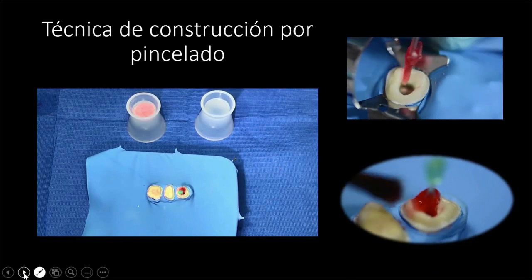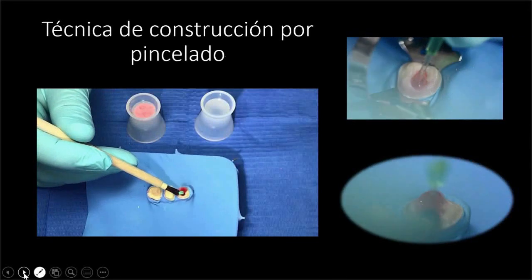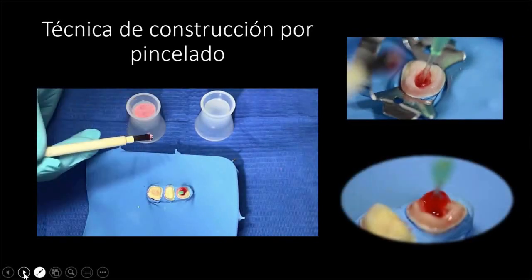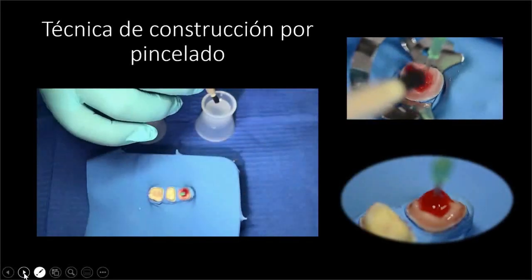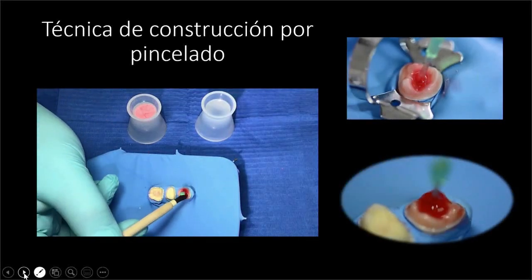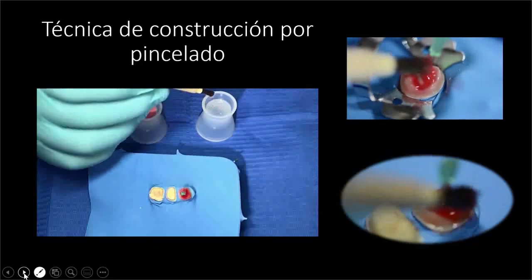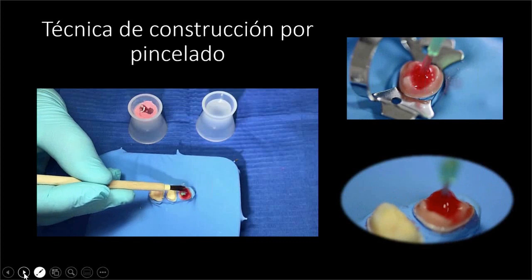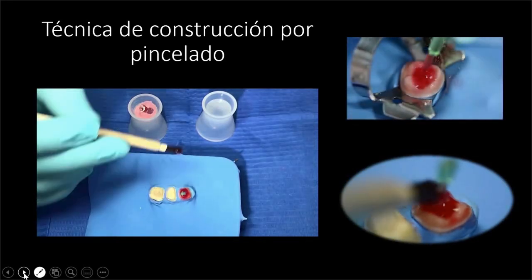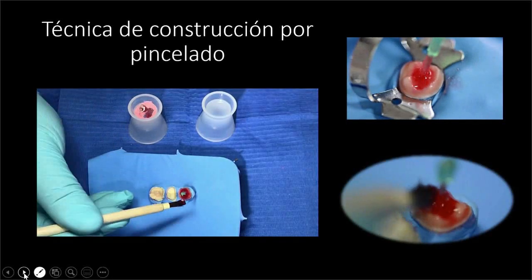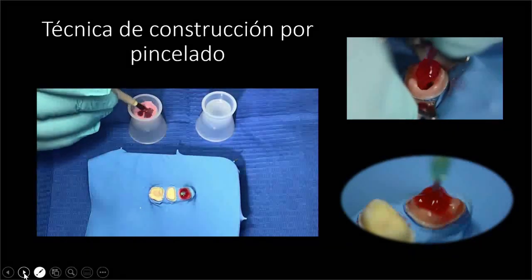Tengo que ir quitándolo poco a poco, probando siempre que se pueda quitar. Estamos fabricando un segundo poste para que veas que cada uno, aunque sea el mismo órgano dental, debemos asegurarnos de que no se quede atorado. Muchos aprendimos en licenciatura que hay que colocar petrolato o vaselina dentro del conducto para que no se pegue el patrón, y la verdad es que eso funciona muy bien, mientras no te excedas, porque si te pasas, la vaselina ocupa espacio y el poste queda desajustado.